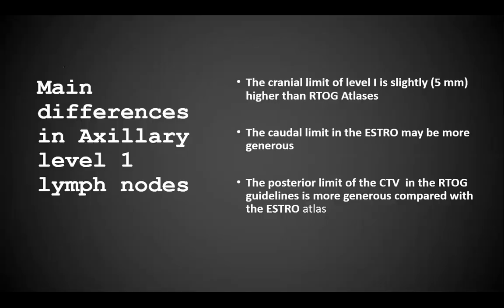So summing up again, here the cranial limit of level 1 is slightly higher. The ESTRO cranial limit is slightly higher than the RTOG. The caudal limit in ESTRO is more generous than the RTOG guidelines. Here, however, the posterior limit of the RTOG is much greater than the ESTRO guidelines, as I have shown in the pictures.